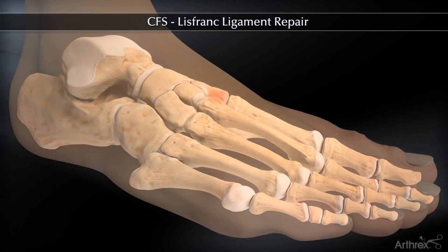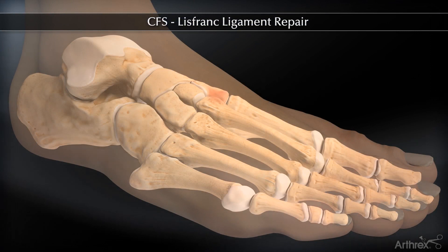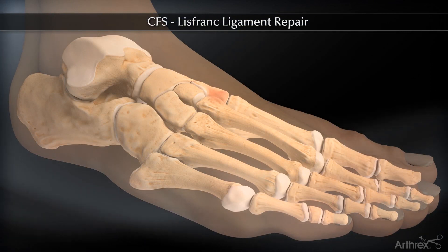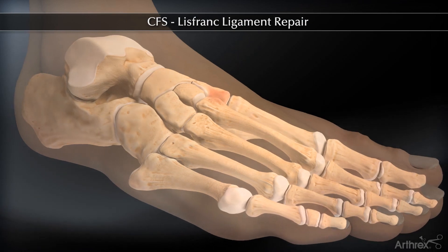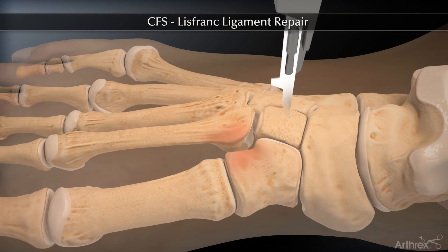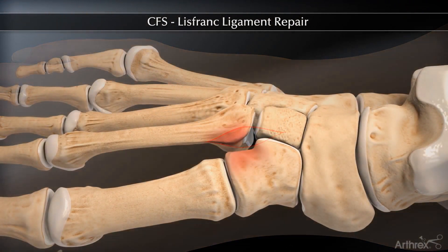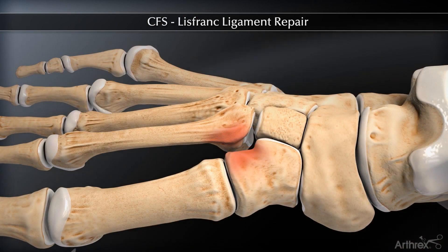The Arthrix Lisfranck plate can be used for acute Lisfranck injuries or TMT arthrodesis. In this animation, we will show the open reduction and internal fixation of an acute Lisfranck injury. The incision is placed over the dorsolateral aspect of the base of the second metatarsal and dissection is performed to expose the Lisfranck injury.